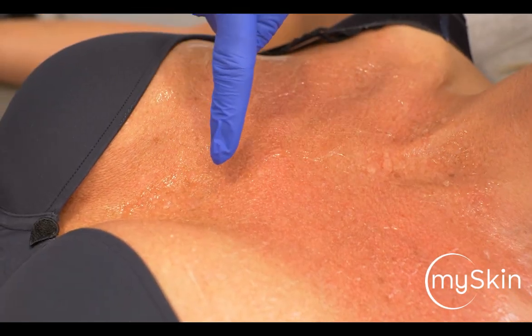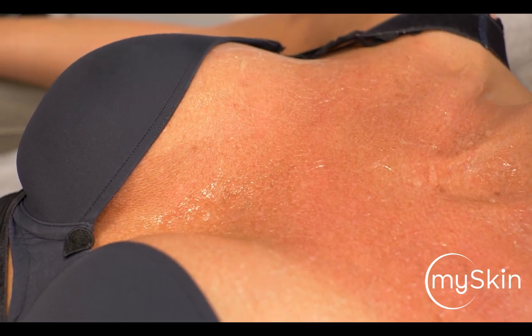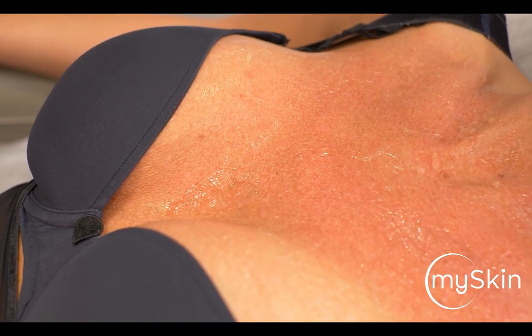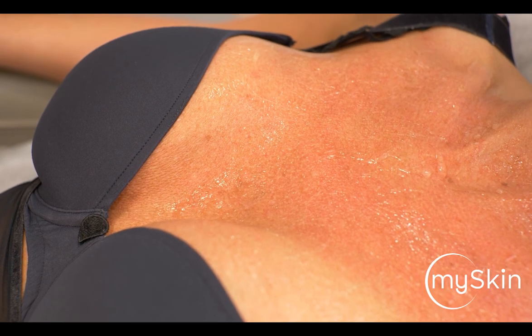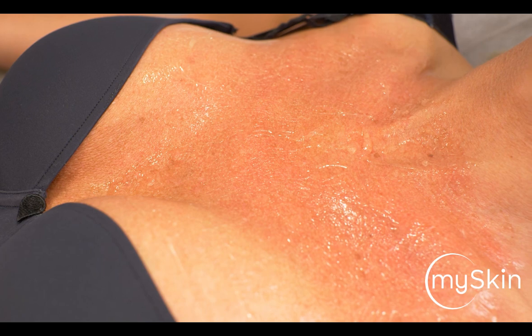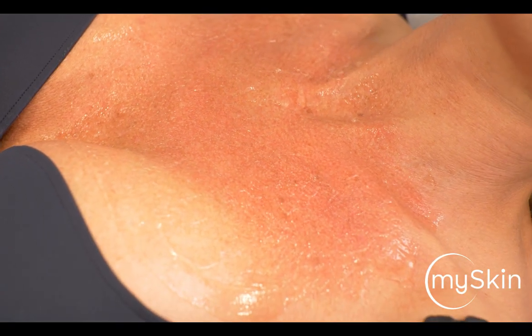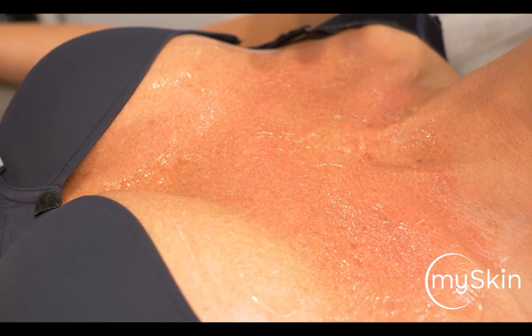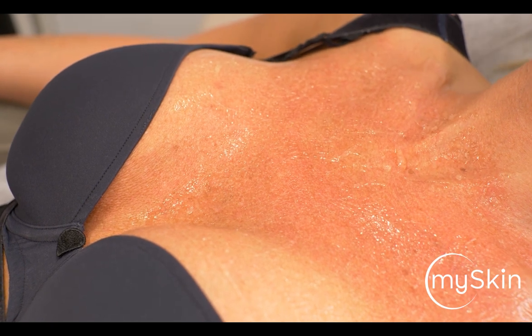We have a great change of color here — a great darkening. This is something we advise our patients about: this darkening process will take about seven to ten days to disappear on the chest, and it always takes a couple of days longer than on the face. Otherwise, there is no wound, no swelling, no discomfort — apart from maybe the next one or two hours where people do experience a little bit of heat.